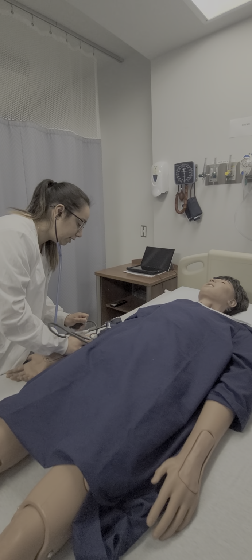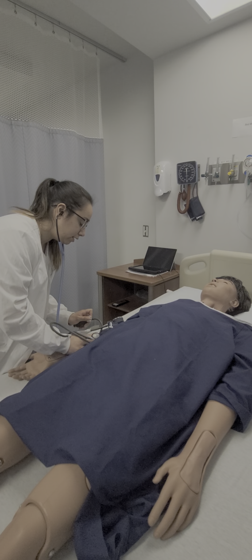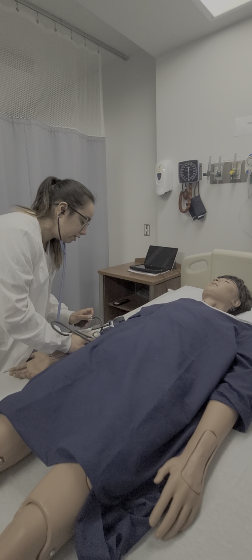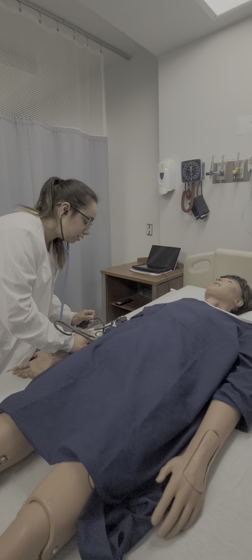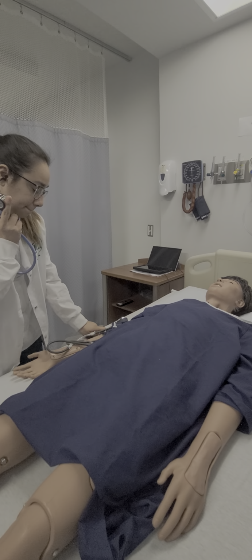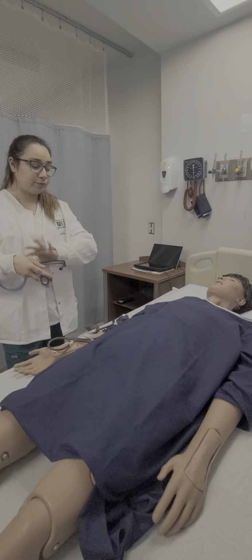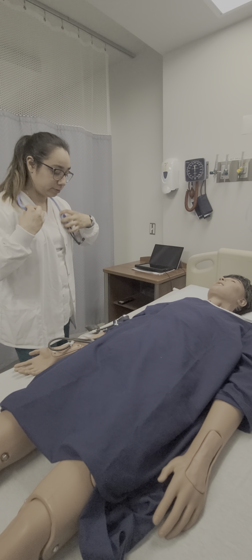I would slowly release some air so that the valve can go down. Check for when the needle moves. Okay. Patient blood pressure was normal. It was 120 over 80, which is within normal limits.